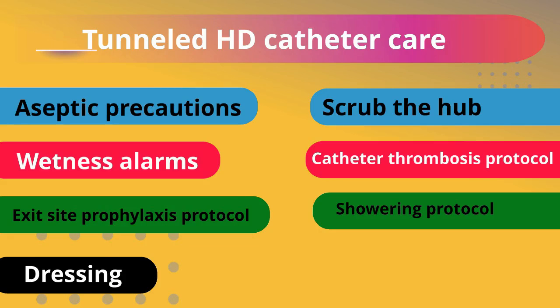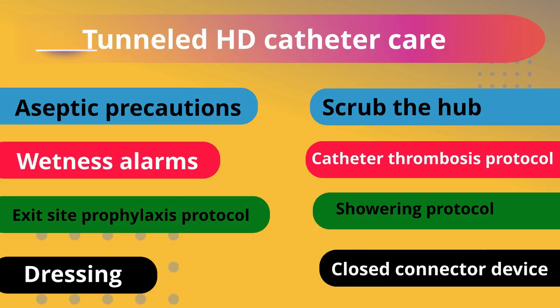Medication-impregnated dressings are used for prevention of central venous catheter-related colonization and catheter-related bloodstream infections. Use of closed connector device is encouraged to decrease risk of unintentional disconnection, air embolism, and inadvertent bleeding.